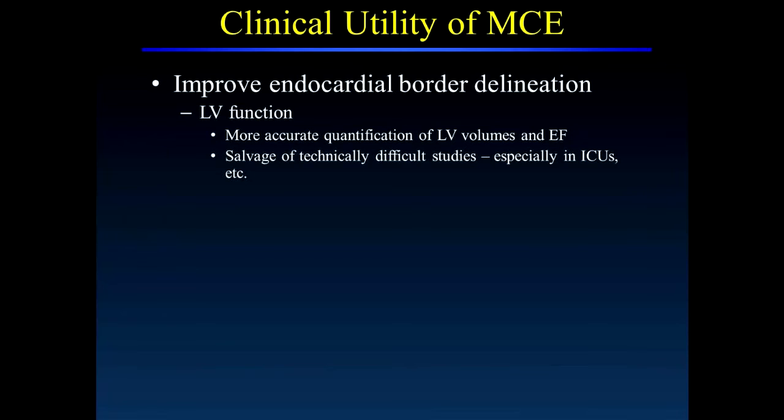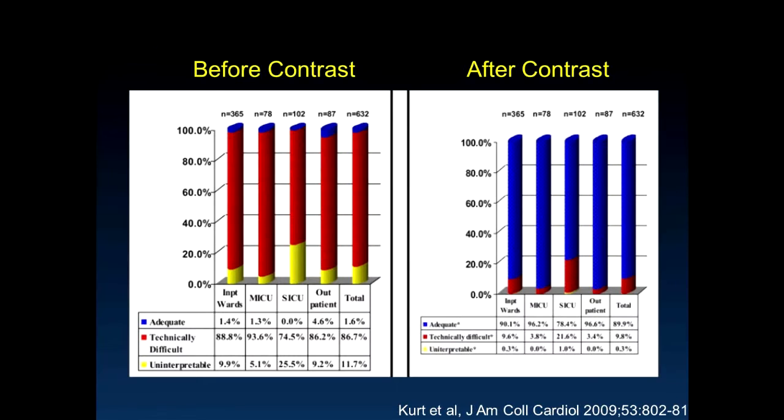Contrast for left ventricular opacification can be used to salvage technically difficult studies and influence patient management. In this study from Baylor, Kurt et al. recruited more than 600 patients with technically difficult studies.